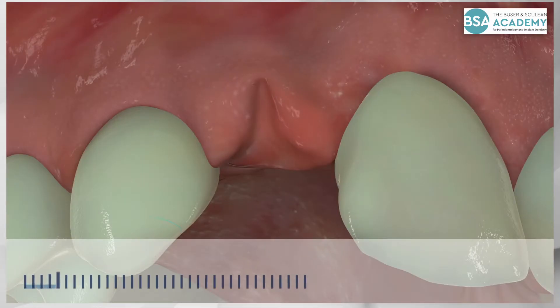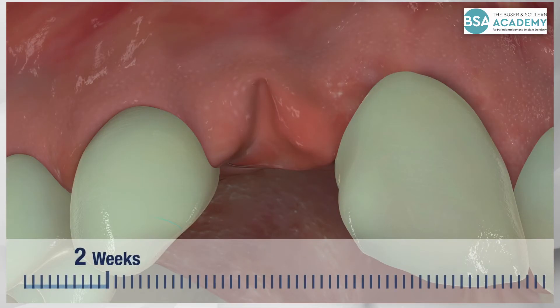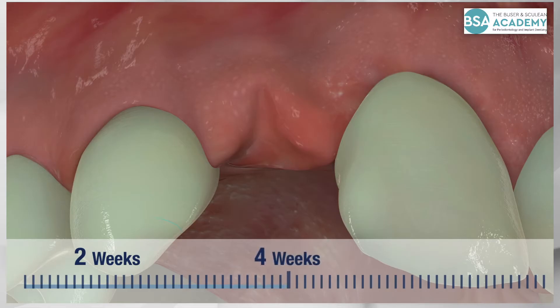During the 8 weeks of socket healing, keratinized mucosa spontaneously forms over the socket. Initially, there is a slight invagination of the mucosa at the crest. Then a gradual flattening is observed on the mid-facial aspect of the extraction socket.